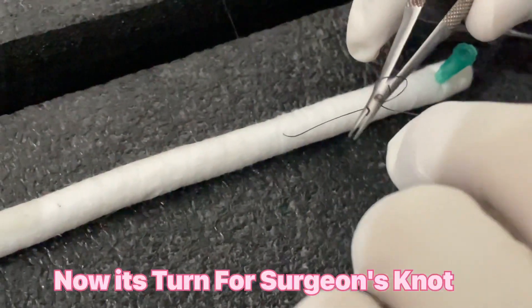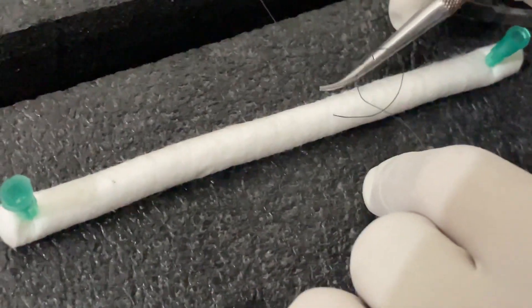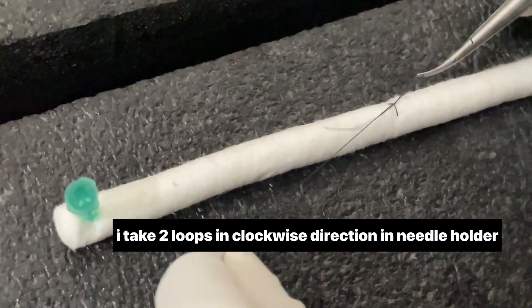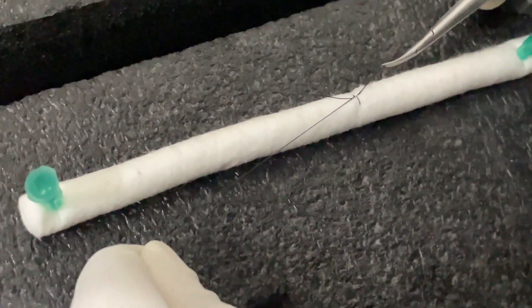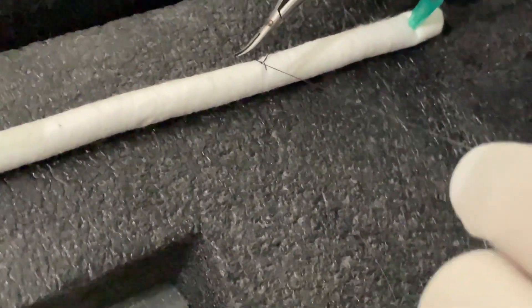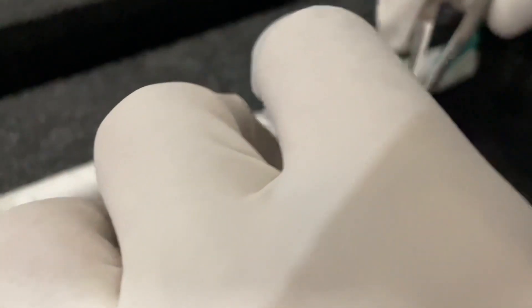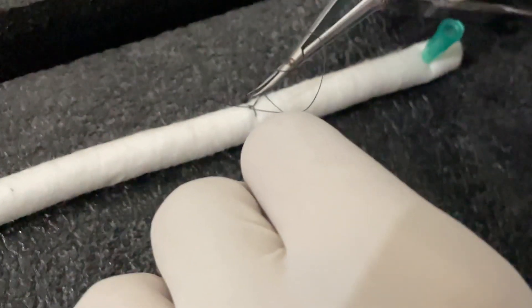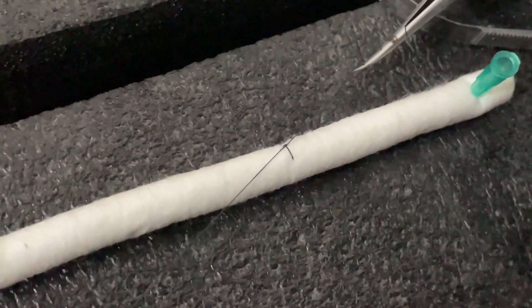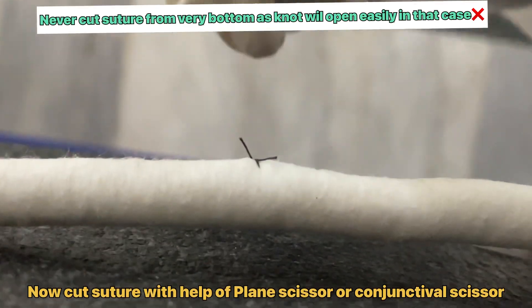Now we will do the surgeon's knot. Take a couple of throws on the needle. Hold the thread with the help of the jaw. Now stretch the threads in opposite directions. Take an extra throw in order to make it more secure. Cut the suture a bit above so that the suture becomes more secure.